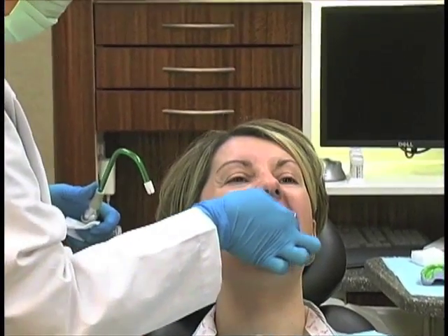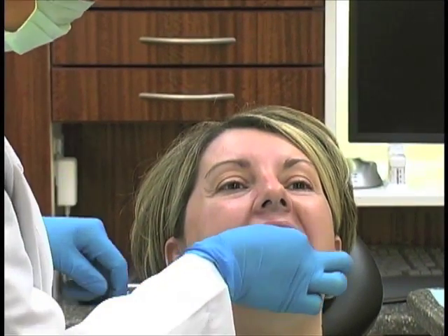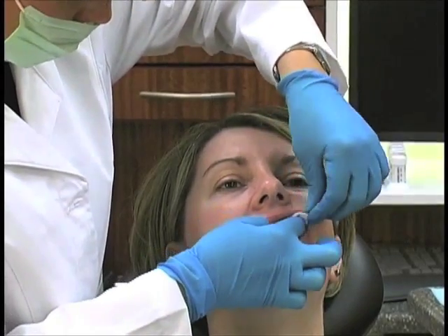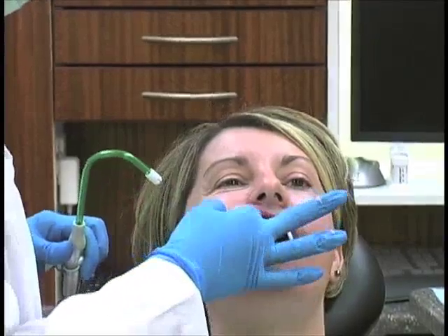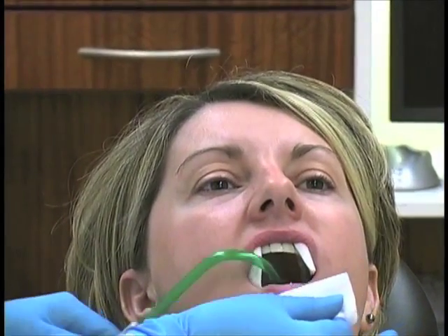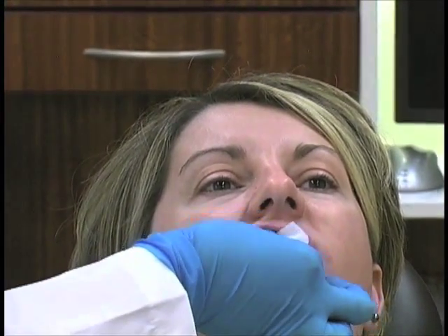Dry the teeth first. It's really important because if you have fluid on those occlusal surfaces, you're going to end up with bubbles. Probably even more important with this material than with an alginate. So get the teeth dry just like you would if you were doing a final impression. Sometimes you feel like you've got a rush here, but you've got a little more working time than you think.